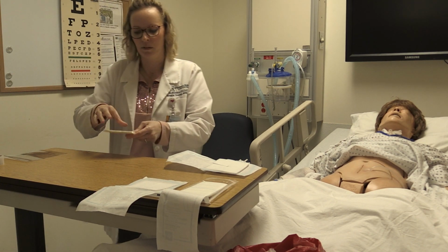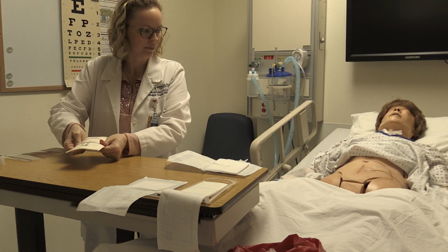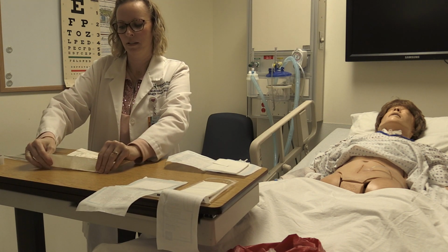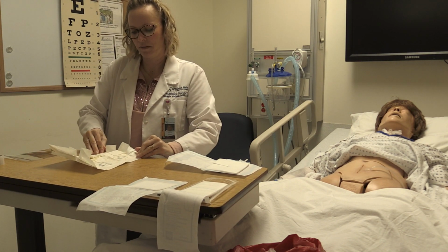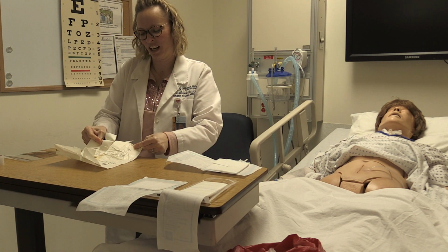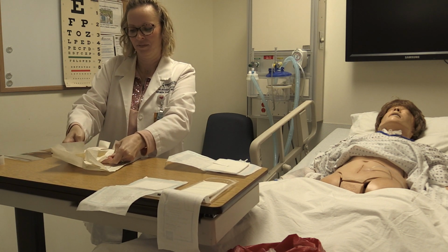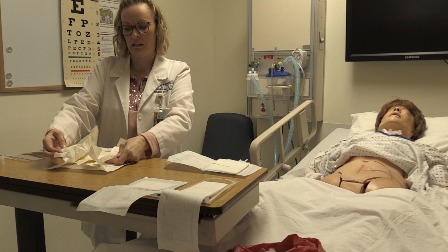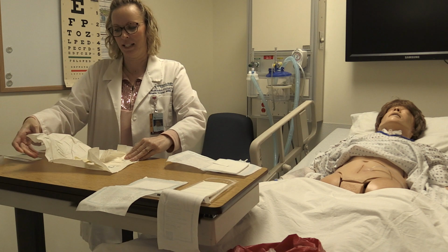I'm going to wash my hands again real quick just to make sure I'm good. You open. Distal. Proximal. These gloves look like they're very wrinkled. I'm a little nervous that they're not going to stick, or that they are going to stick. Got it.